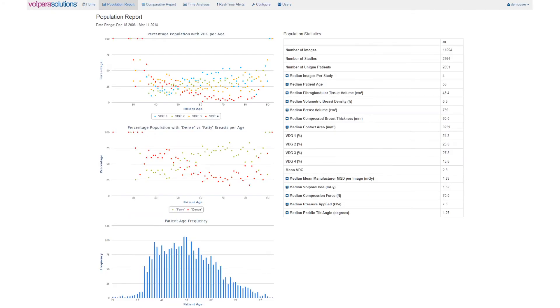This population report gives you high-level data for the population you are screening, which can be used to evaluate and manage staff and equipment resource allocation for maximum effectiveness. Volpara Analytics is scalable and can be used by a clinic with a single mammography unit right up to a large multi-site network.